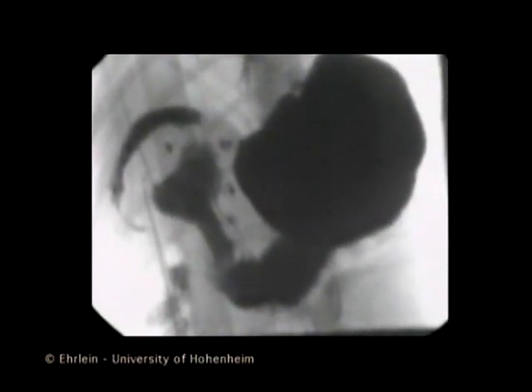The dog was fed with mashed potatoes with a consistency similar to solids. The material is mainly retained in the gastric reservoir, which is markedly relaxed. Only small quantities of the solids are transferred to the antrum.